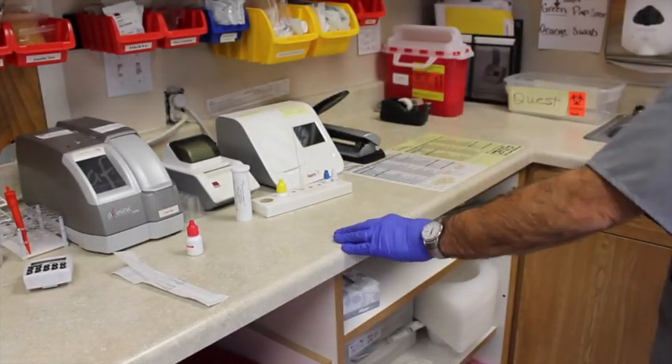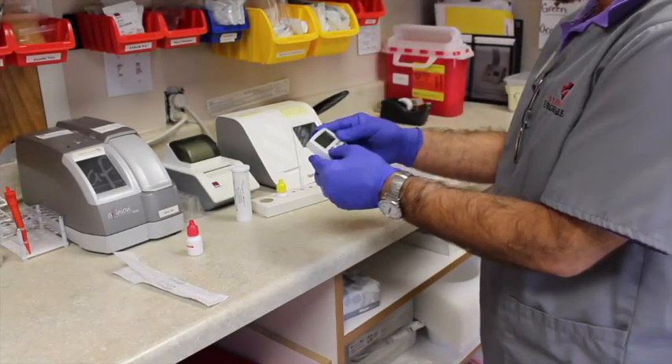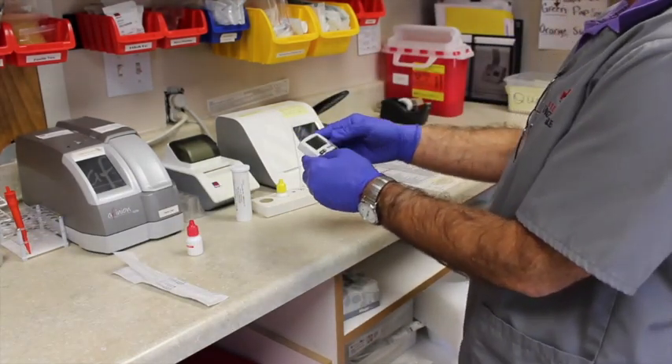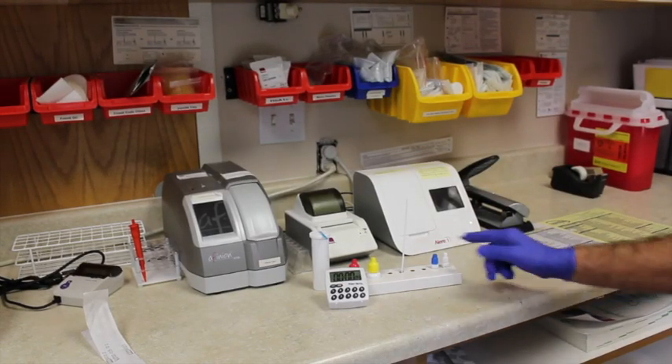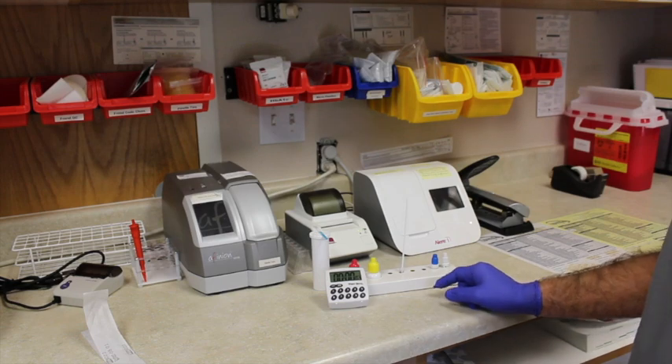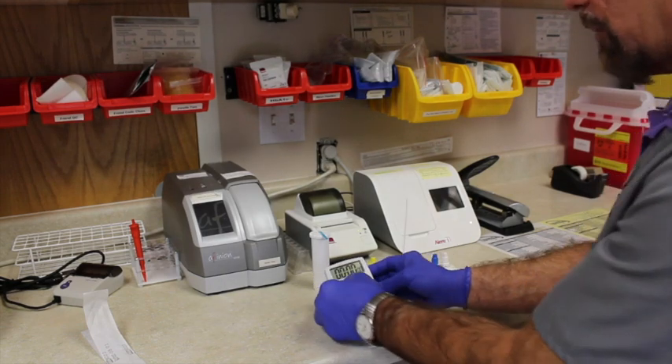Then you set that there for one minute. Always set the timer. It sits in the tube for one minute until the timer goes off.